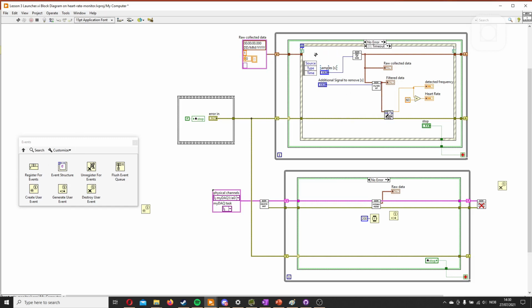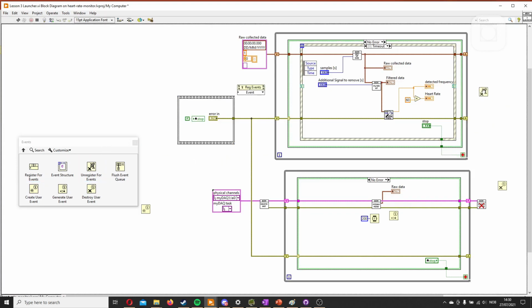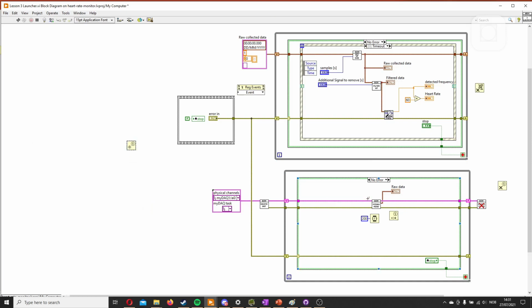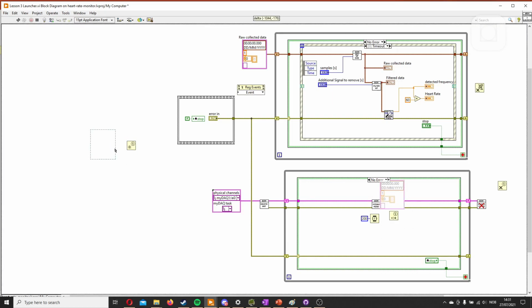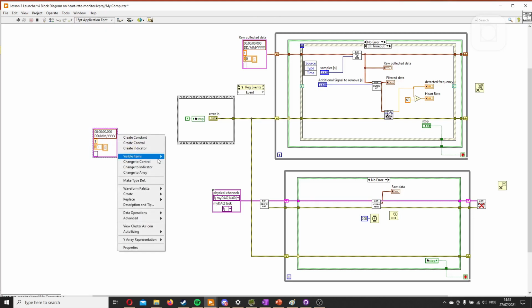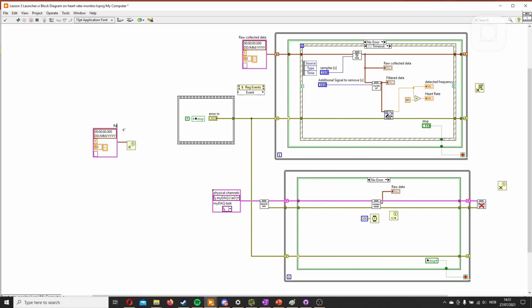And for this one to know what to get in, we will need to register the user events and then unregister them when the loop is done, in addition to the other elements. So now we've picked up everything from this menu, we will just close it. The data we want to send is the raw data. What we'll do is just to create a constant here, and we'll put it in here. And then we'll show the label. Visible label. We'll call this raw data, as we've done. It's important with the name because this is what the user event in here will be called later. We want to ensure that this starts before everything else, like we did with this one.